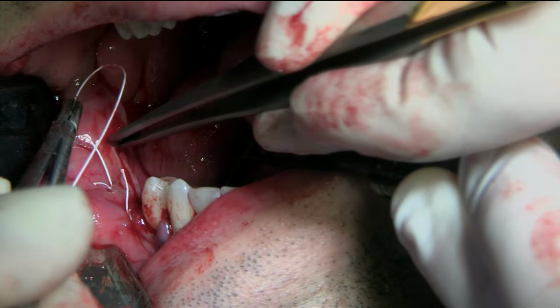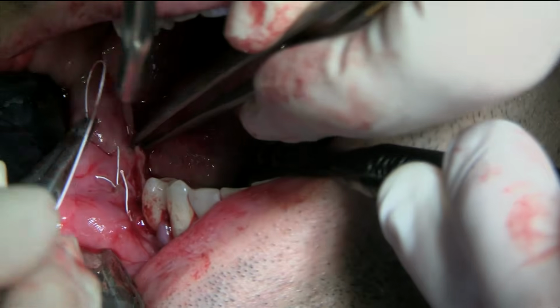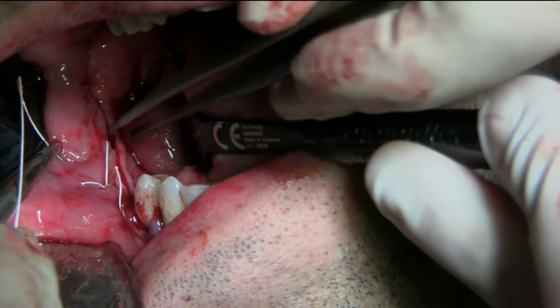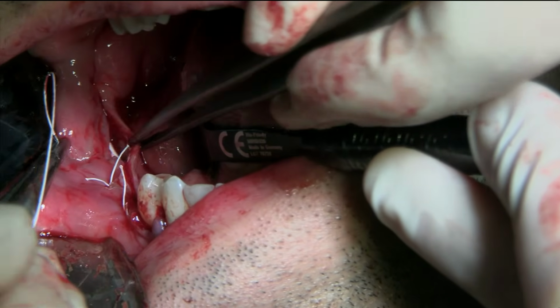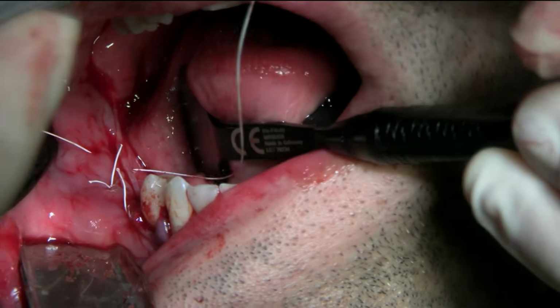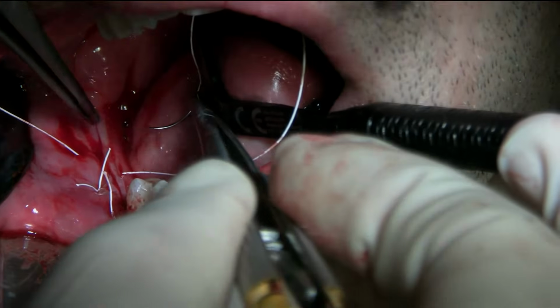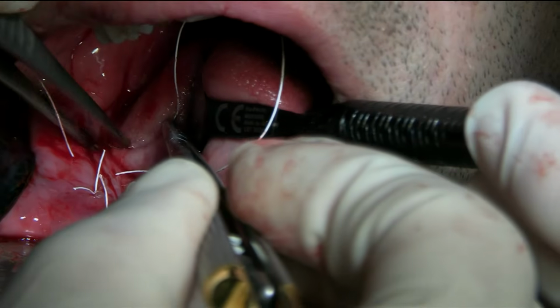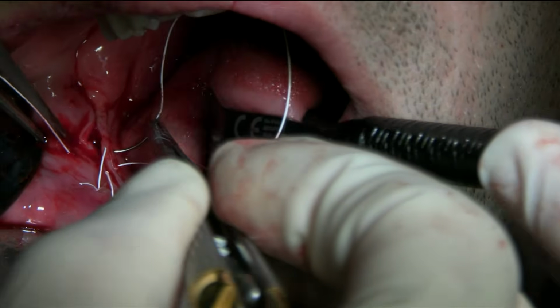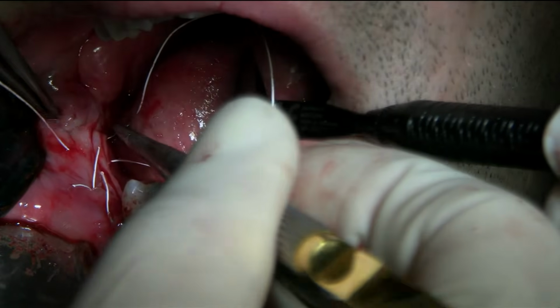Okay, my next mattress. Now it's ready. The flaps are so nicely in position that I can just go from the buccal straight through, there we go, to the lingual. So that's one pass. After this suture, we're going to have to switch to a new suture. Tatiana, can you open a new suture already?